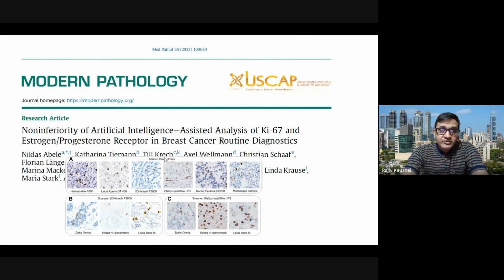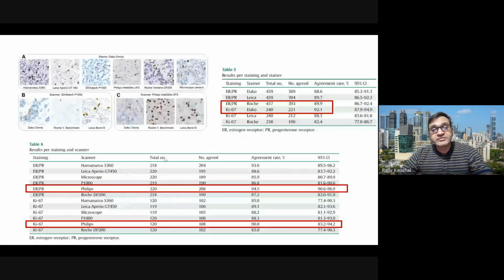Next question that comes: if I'm adopting any AI-based applications, there's a matter of concern that the platform which I use for performing these slides, or even for the scanning of these slides, can have an impact on the results. And people are also working on that, testing these models across various staining platforms, or even various scanners.